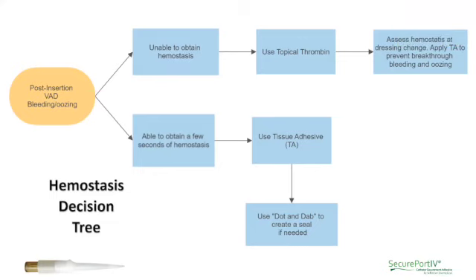Right. Sorry, along with the dabbing, as far as the sterile included gauze, is there risk of lint remaining on the insertion site post application of the Secure Port? Normally I let that dry as best as possible, give it a long dry time, and then is there risk with dabbing that area with any kind of gauze material being left?